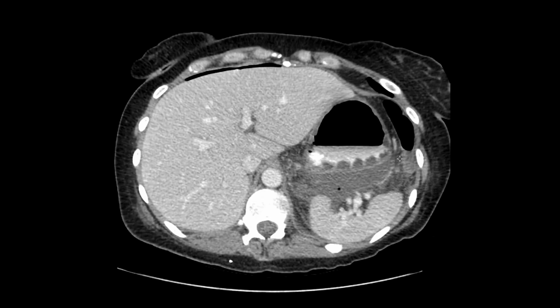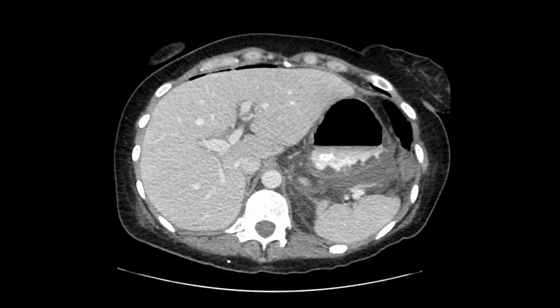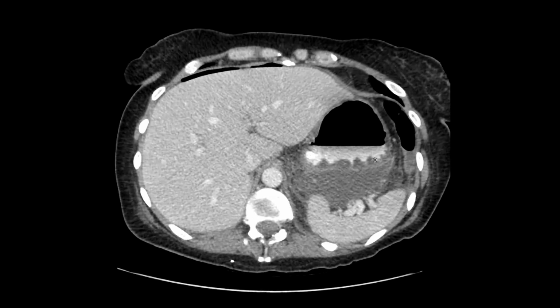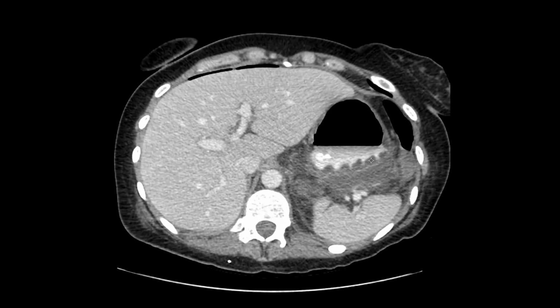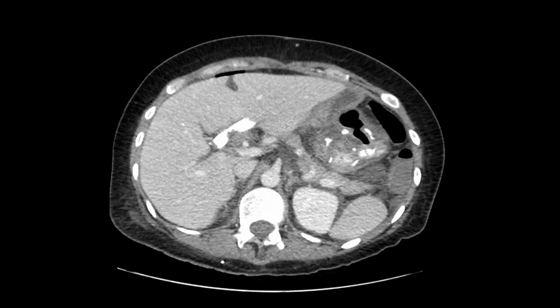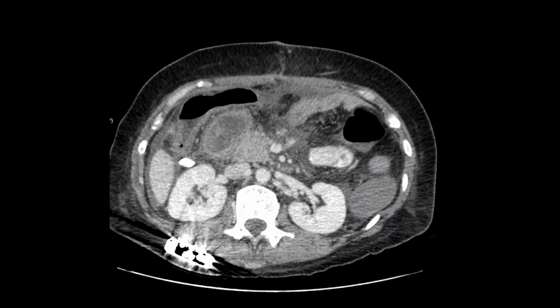However, the patient has a little bit of a white count, so they're going to track it. If the white count gets worse, boom, abscess. They're going to have to treat it. If the white count goes down, then they'll probably just watch it. All right. So, yeah, the stomach is connected up to this piece of jejunum. That looks great. Nice.